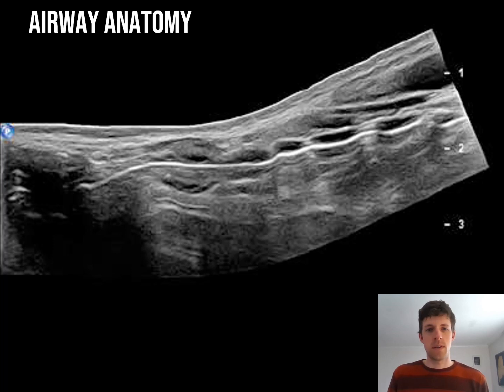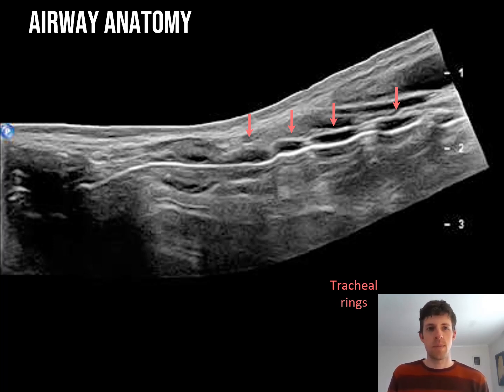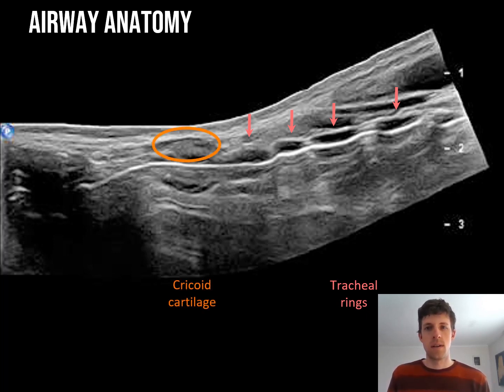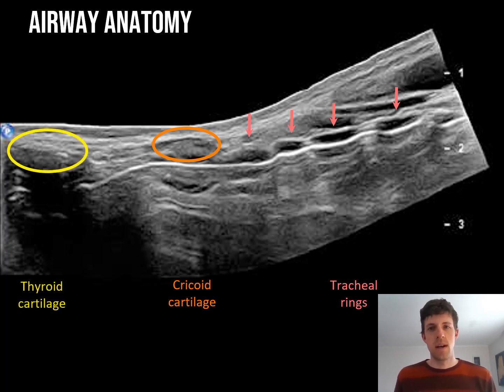This is the anatomy you will be looking for. I typically start with the most caudal landmarks, the tracheal rings. These are identified classically with the beads on a string appearance. Once you identify those, you can slide your transducer cephalad until you see the cricoid cartilage, which is sometimes described as a hamburger. After locating this, continue to slide cephalad until you find the thyroid cartilage. Your target, the cricothyroid membrane, will appear as a bright white line in between.